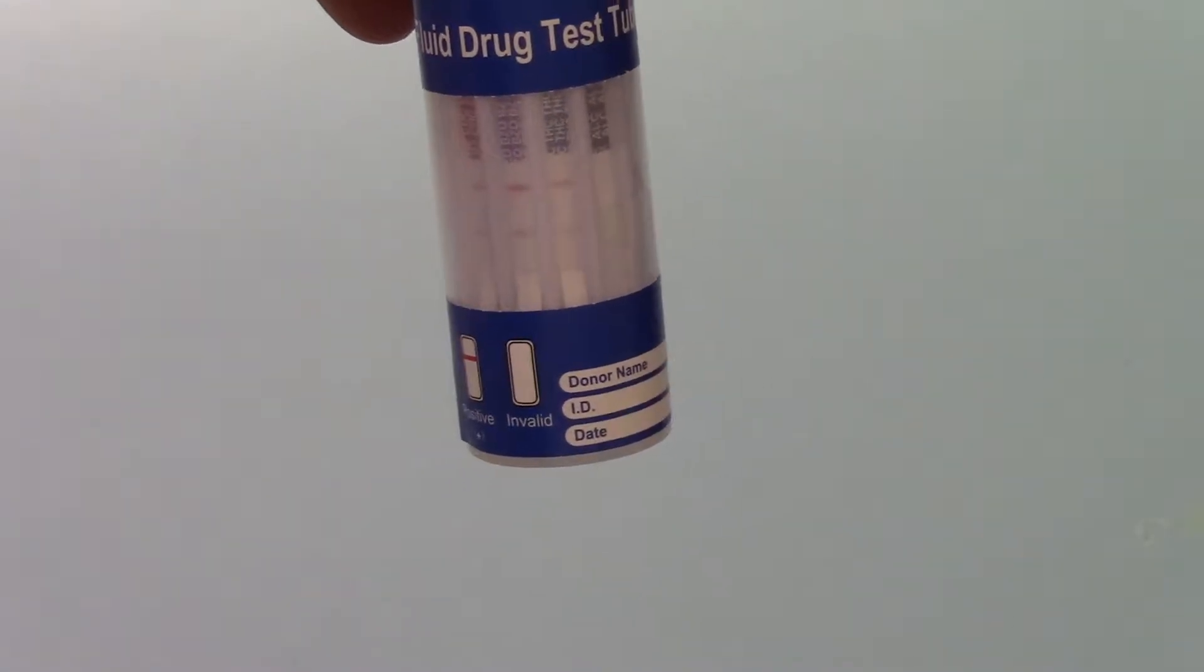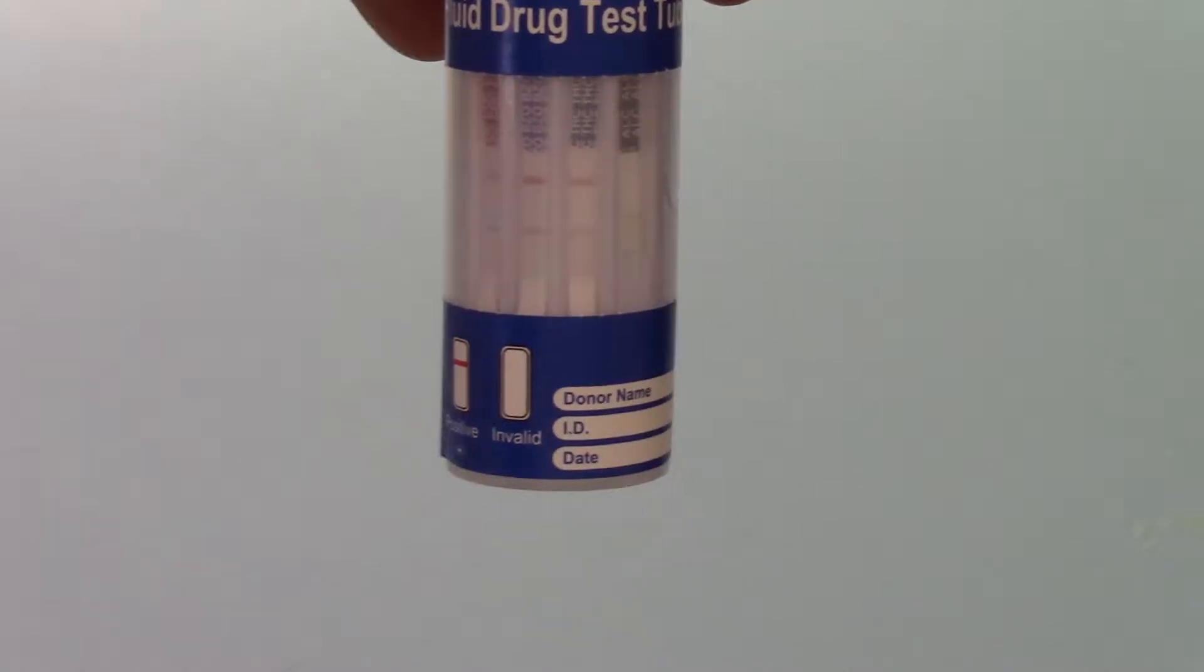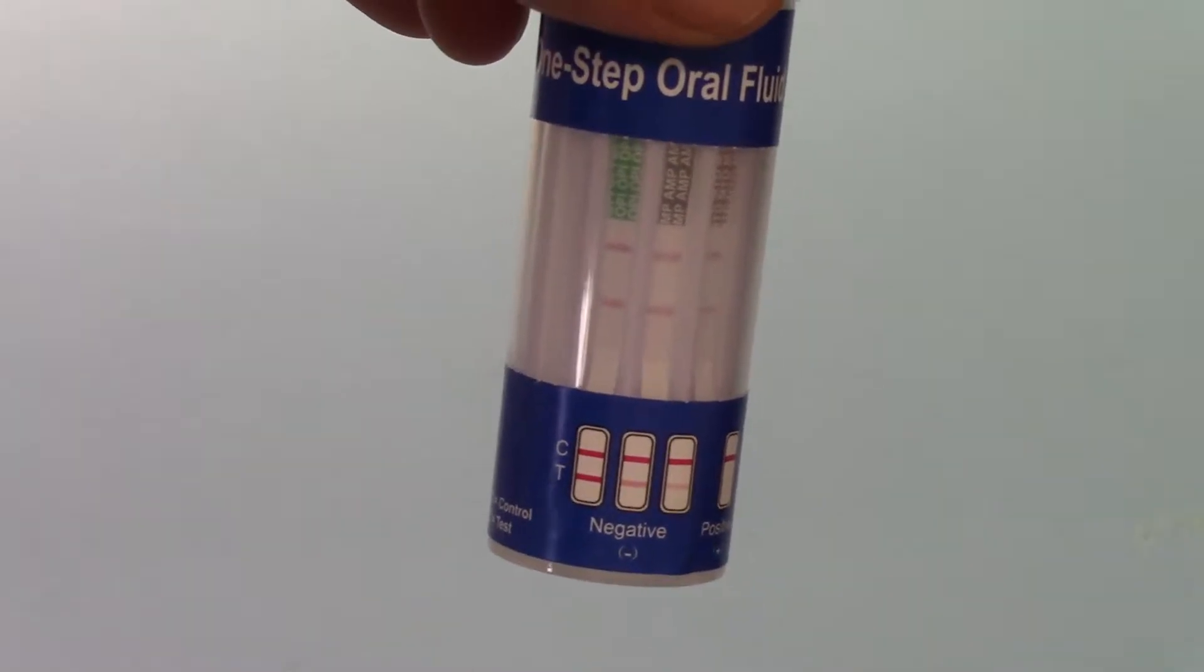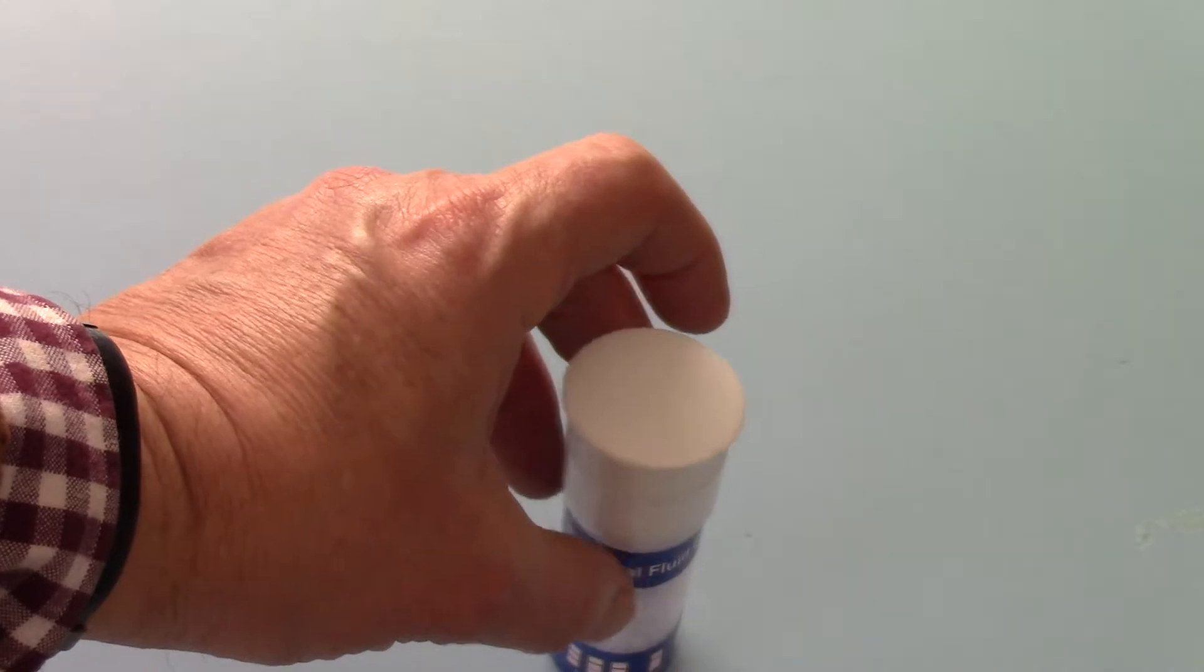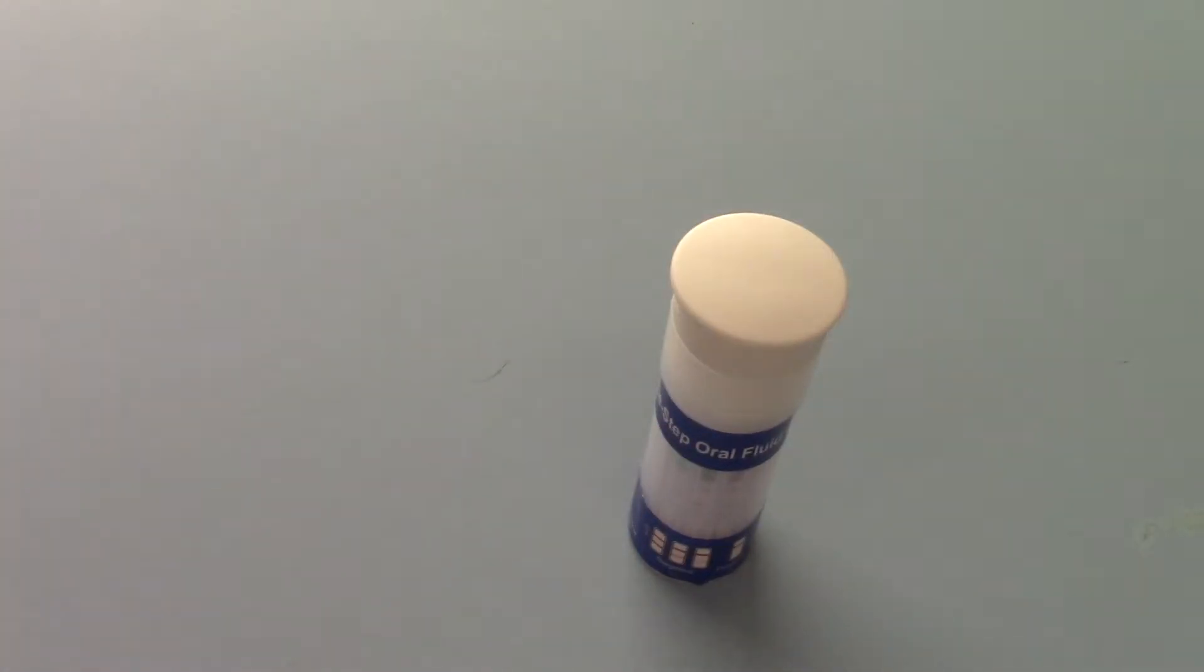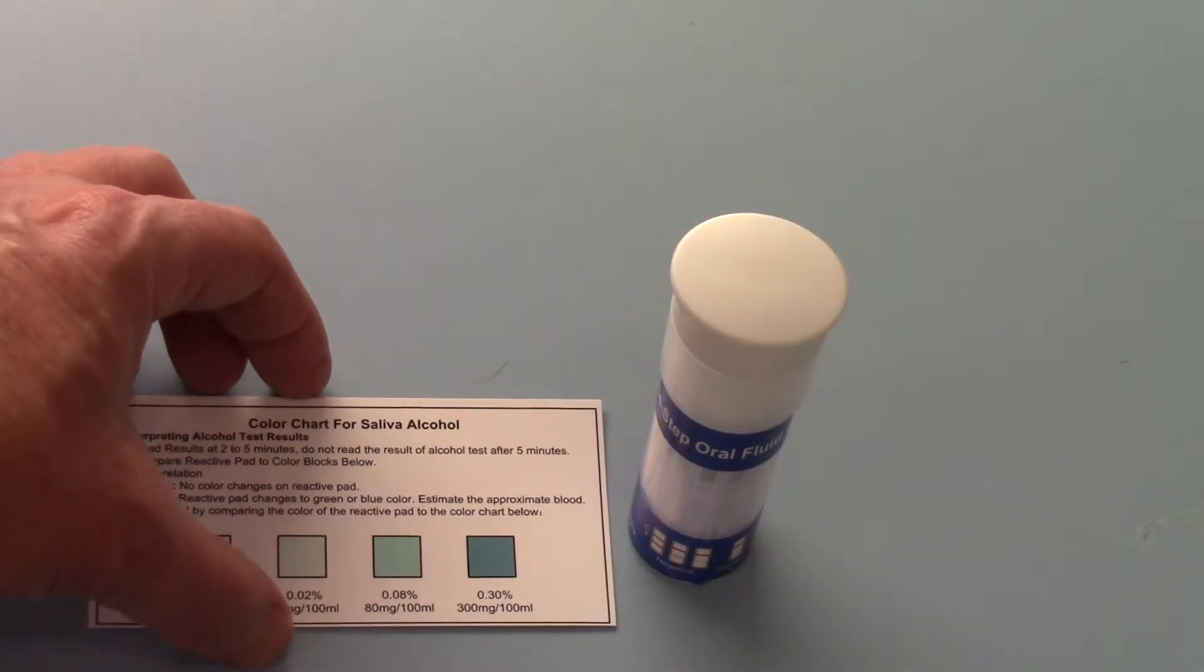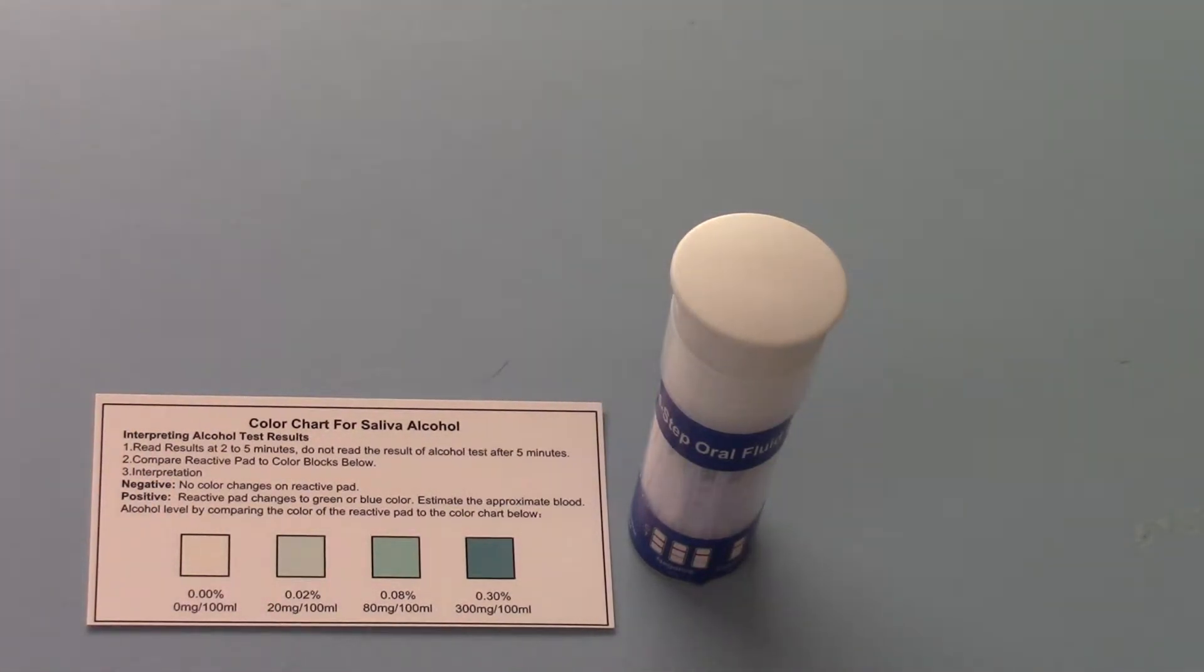But if you do leave it for hours what you can see is the development of very thin ghosts or T lines developing in some instances. You must interpret the results at the given window period for the results, which for this manufacturer is between five and ten minutes on this particular test. So anything that develops beyond that time has to be ignored. It's of no consequence. It's just the biotech continuing to run and develop. But you've got to read the results which are showing at that maximum read time which is ten minutes.